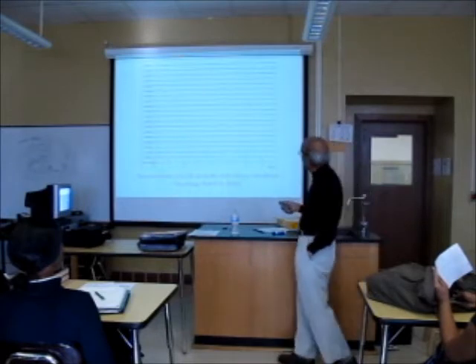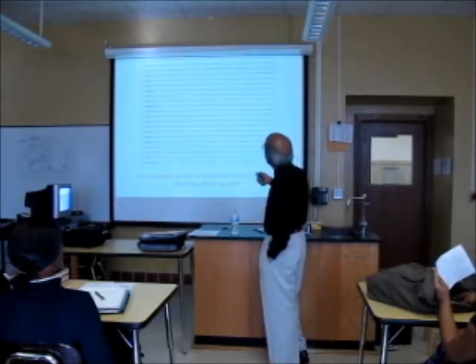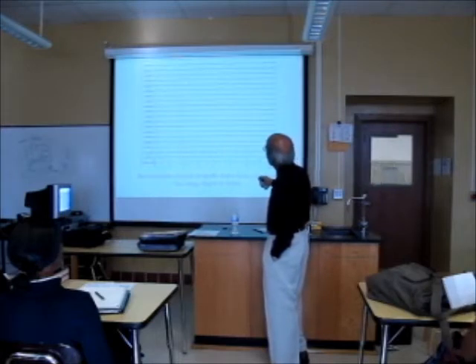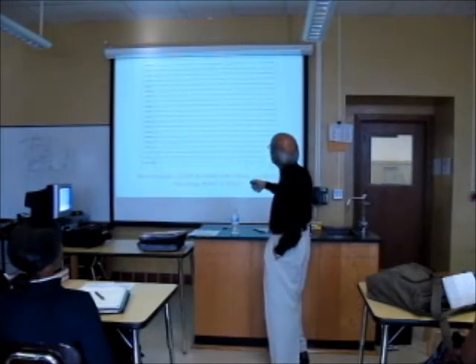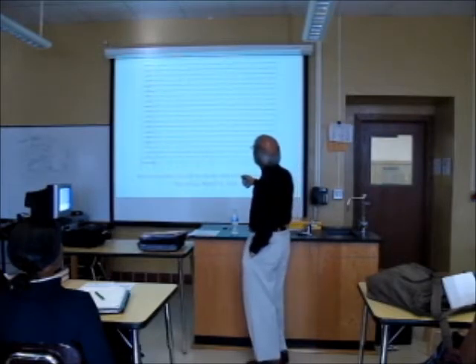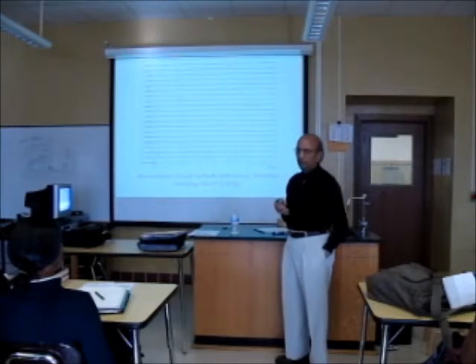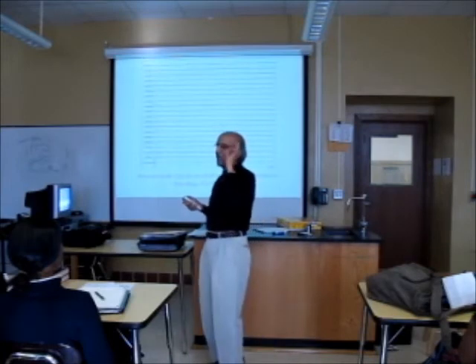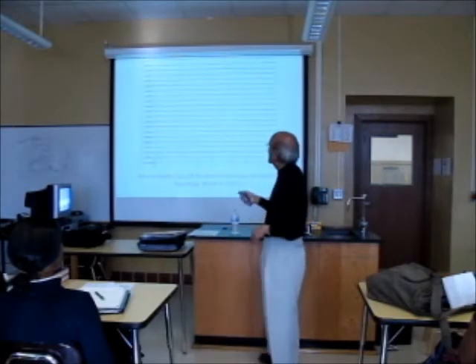It's very difficult to explain each in a few minutes, but these four electrodes are on the left, on the right, and we compare this with this, second with the sixth, third with the seventh, fourth. Let's pay attention to this. These two solid lines represent 1 second. Okay? And the brain activity is in different frequencies.